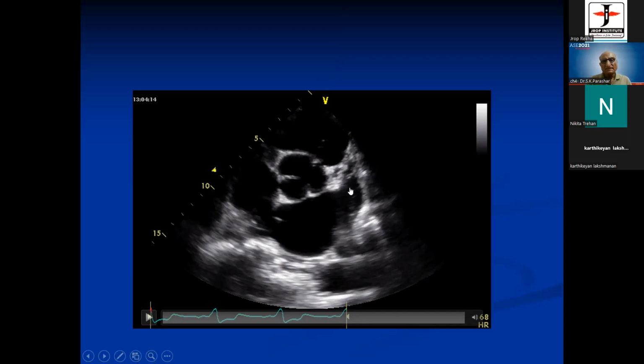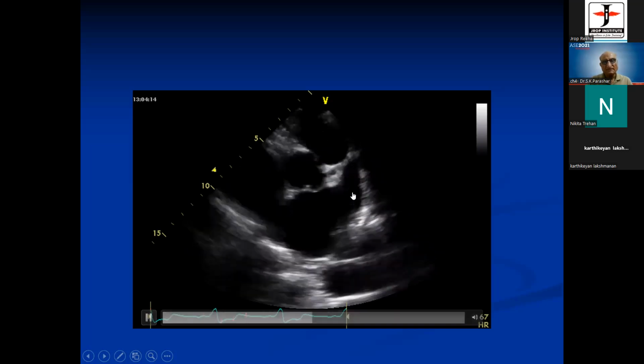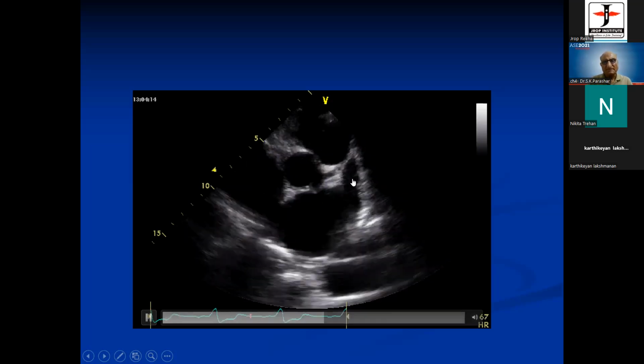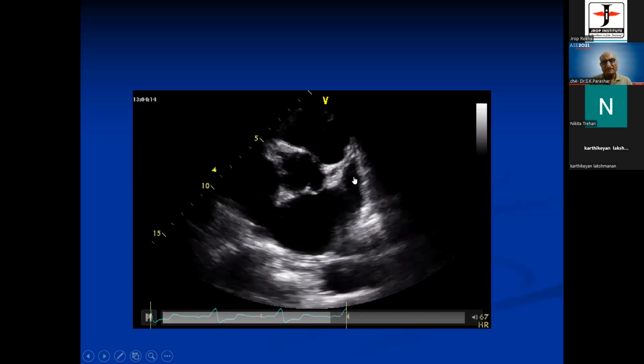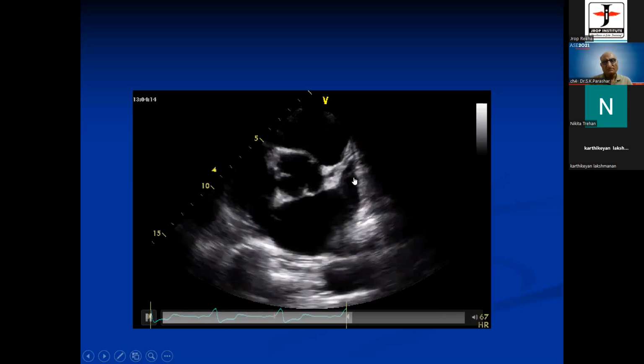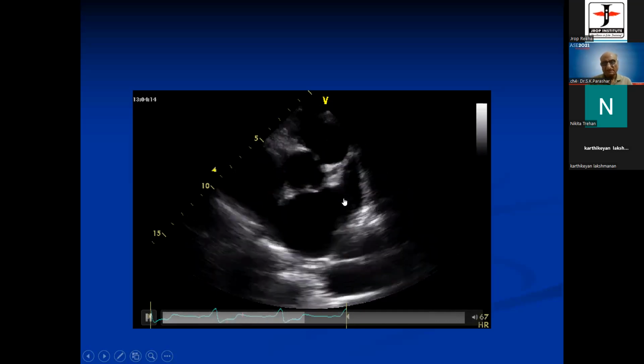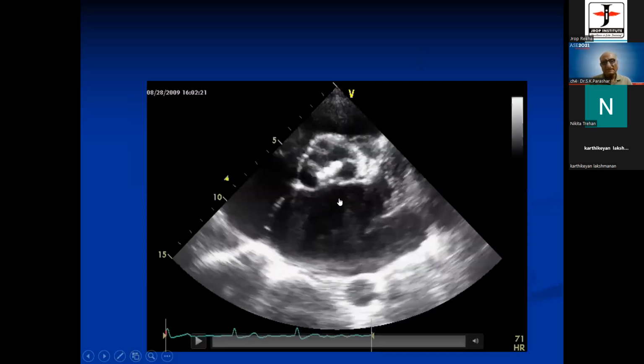Now, a thrombus may be there, but it may not be seen on a transthoracic echo, but may be seen on a transesophageal echo. So this is how you see. In these cases also, you see this is the finger-like projection, and this is the left atrium. So just go on practicing, and you will very easily get it. And you see there is no clot here, because normally transesophageal echo is the most important technique to see this. As compared to this, this is another patient.